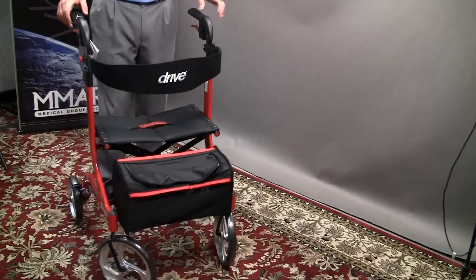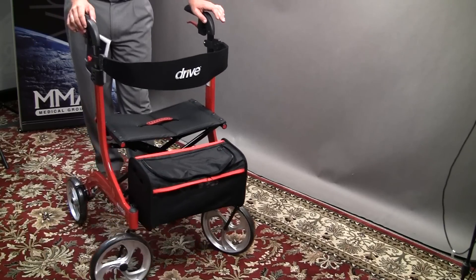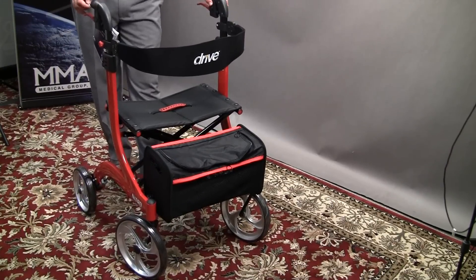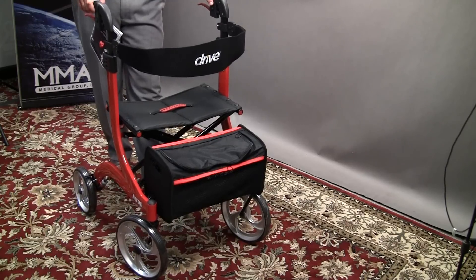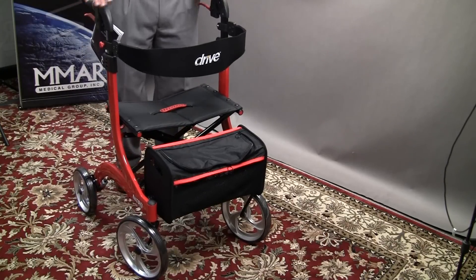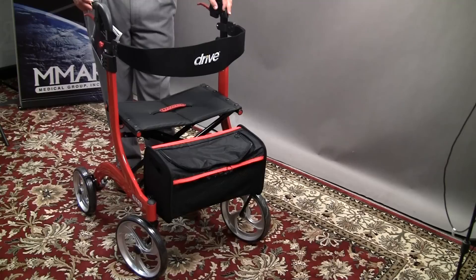The next big thing about the Nitro Rollator is that typically a rollator folds from front to back. What most people fail to consider when they buy a rollator is that the average width of a bathroom door is about 27 inches, and the average width of a rollator is typically around 27 inches or more. That means when somebody has to take a rollator into the bathroom, they're trying to fold it up and slide it through and maneuver their way in, which causes a safety issue in the home.